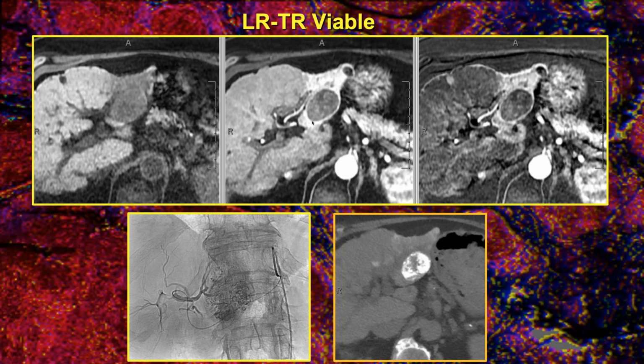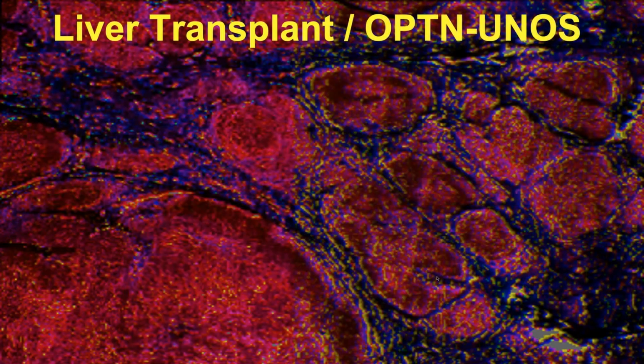That is, we had patients who had local regional treatment and then went on to explant, and we isolated the case where there was viable tumor that we didn't see, and invariably it was because of incomplete necrosis. And when a pathologist says incomplete necrosis, that is often not a glob of tumor and a glob of necrosis, but microscopically, necrotic tumor with islands of viable tumor. And those will show mild enhancement increasing over time. In any event, angiographically confirm the tumor, repeat chemoembolization, and patient did well.